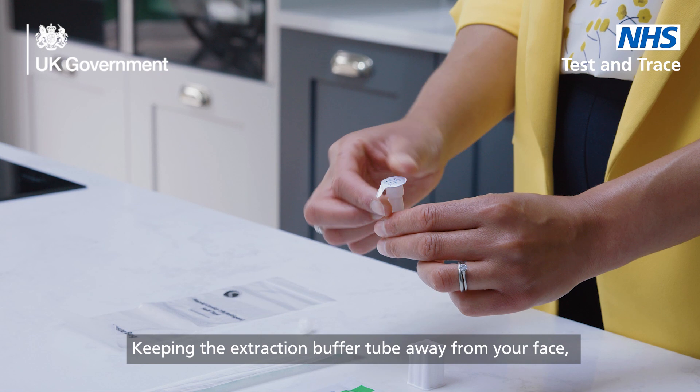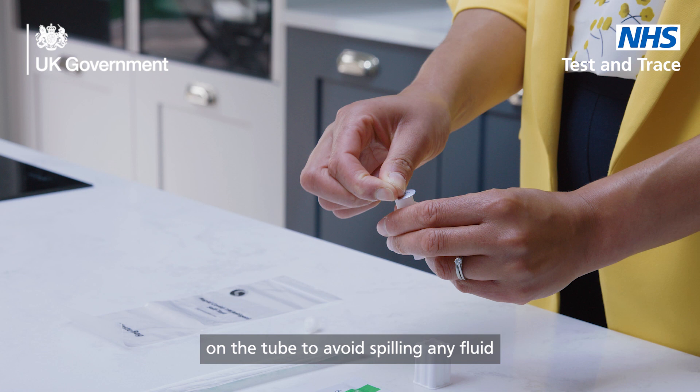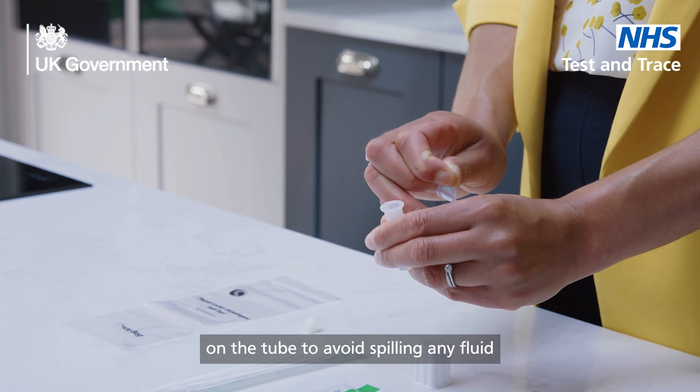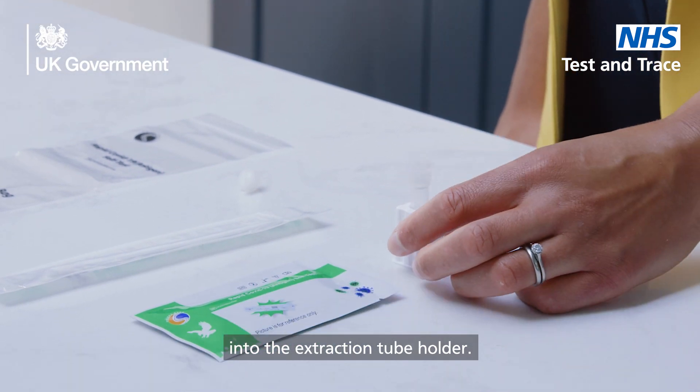Keeping the extraction buffer tube away from your face, carefully peel off the sealing film on the tube to avoid spilling any fluid. Place the extraction tube containing the buffer into the extraction tube holder.